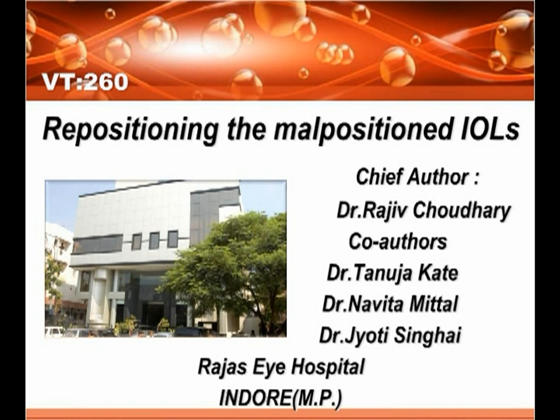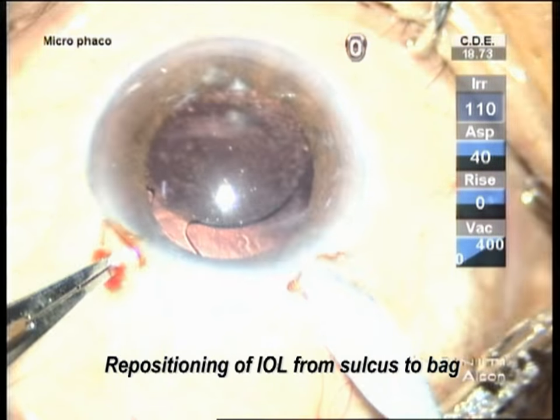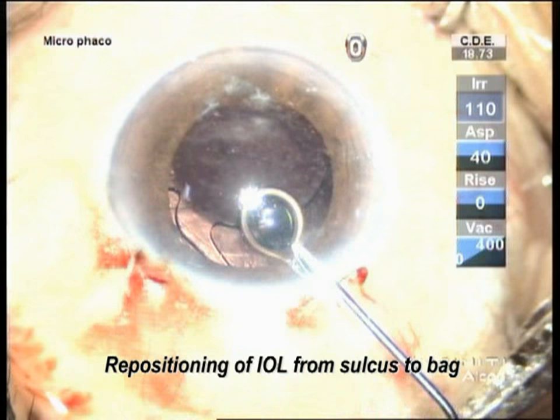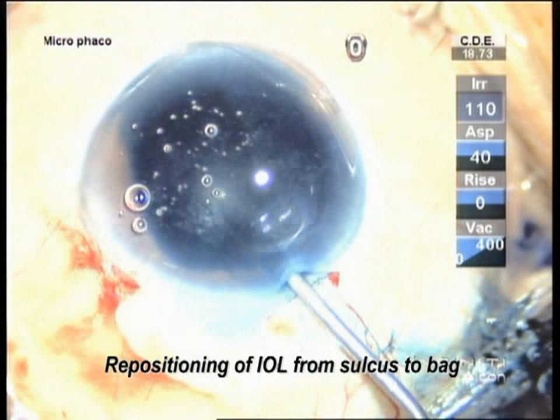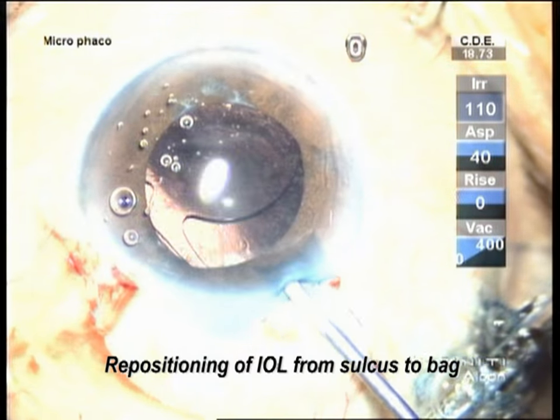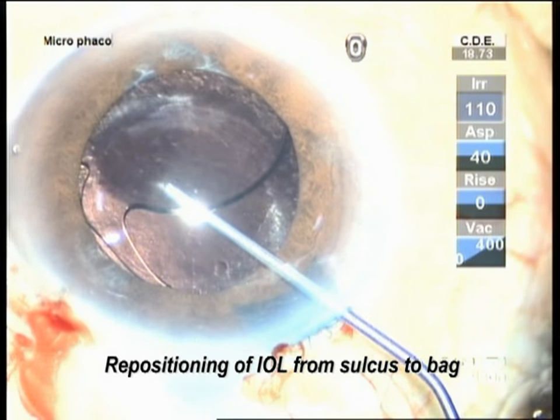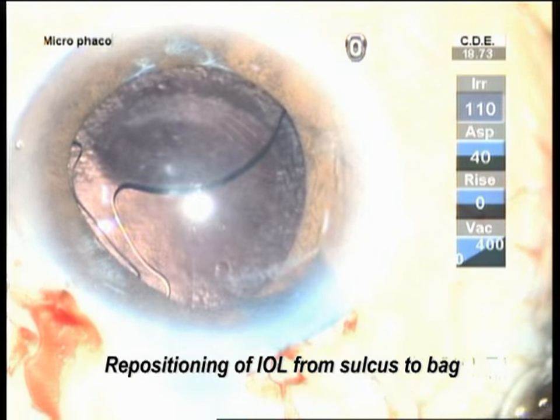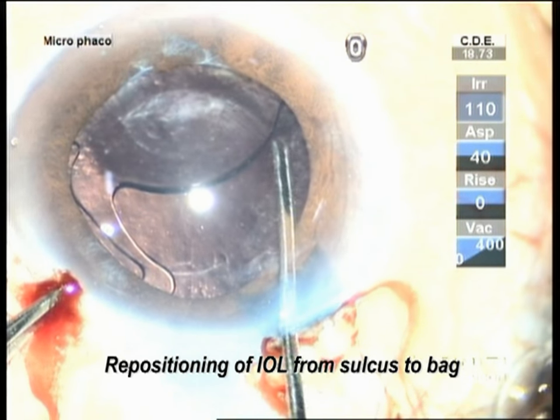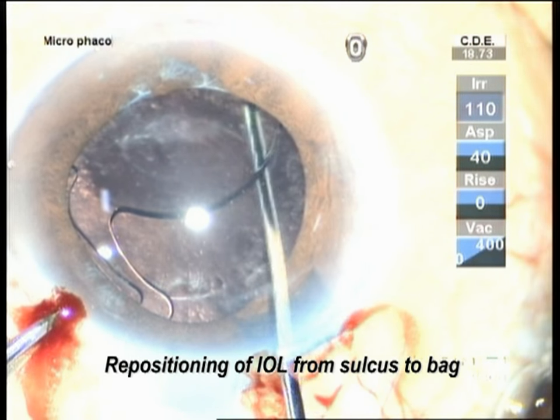Repositioning the malpositioned IOL. Many times we encounter cases where the lens was malpositioned because of some or other reason. We are going to deal with a number of cases where the lenses are malpositioned and how we can easily manage them.